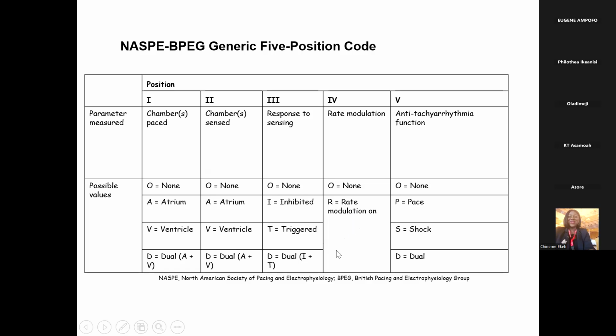So it means that when the patient needs to do activity that can take him as high as up to 130 beats per minute, and his own intrinsic activity cannot go that high, the rate response will kick in to increase the heart rate to at least its upper rate limit.